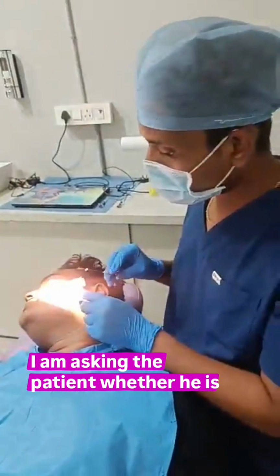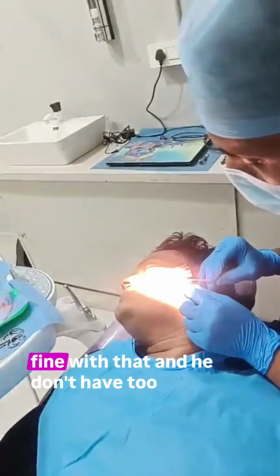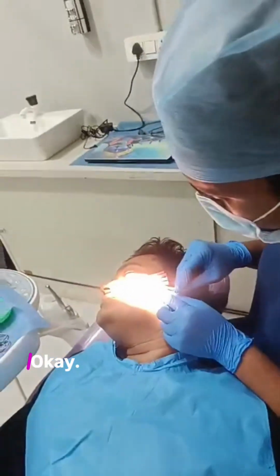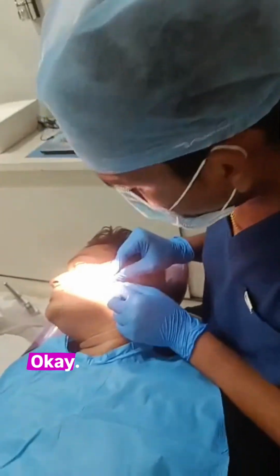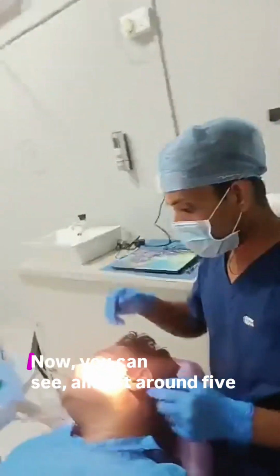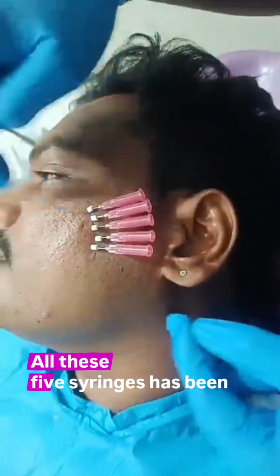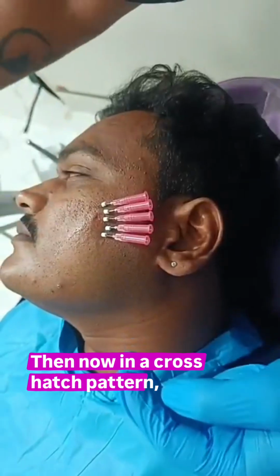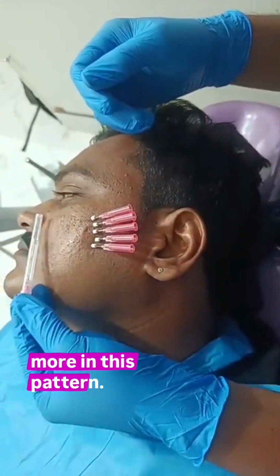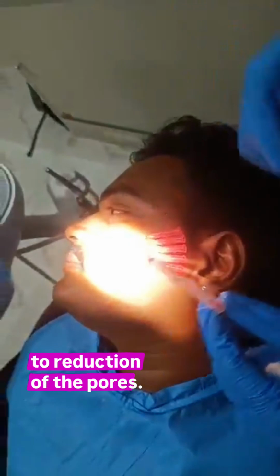I am asking the patient whether he is feeling comfortable with the procedure or whether he is having pain. He told me he was absolutely fine and doesn't have too much pain. Now you can see almost 5 needles I have inserted over here. All these 5 syringes have been inserted in the direction where there is more density of the pores. Now, in a cross hatch pattern, I will be inserting 5 more, so that it will lead to collagen formation and reduction of the pores.